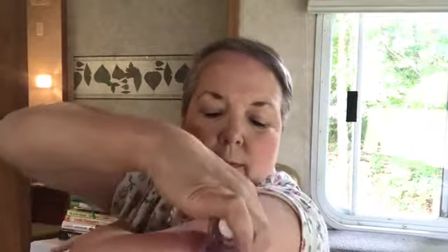There, got it off. And then what I need to do is get my transmitter, and I put the transmitter, the smaller side goes first. Ouch! Oh, I hit myself with my own transmitter. And I push that there, and then I take the bar, that's in, and then I just take that off. I can get it off there. And now my Dexcom is on.